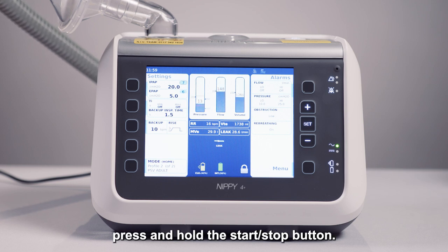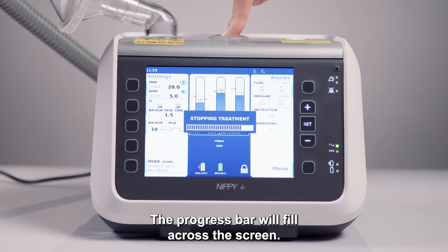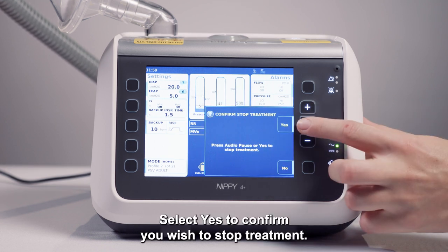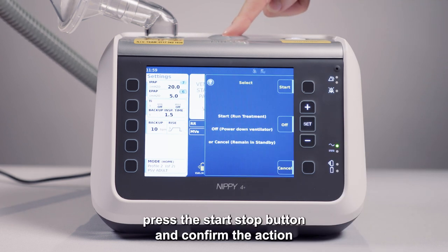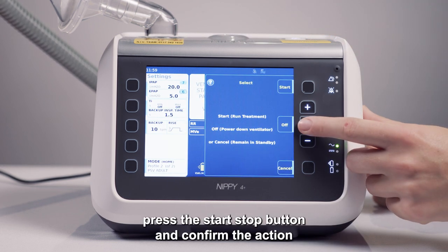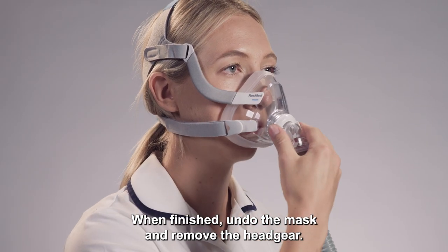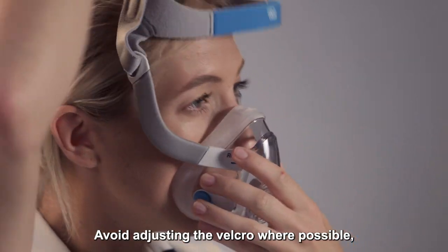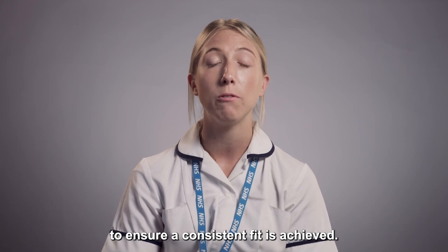To stop ventilation, press and hold the start stop button. The progress bar will fill across the screen. Select yes to confirm you wish to stop treatment. To turn the device off, press the start stop button and confirm the action by selecting off. When finished, undo the mask and remove the headgear. Avoid adjusting the velcro where possible to ensure a consistent fit is achieved.